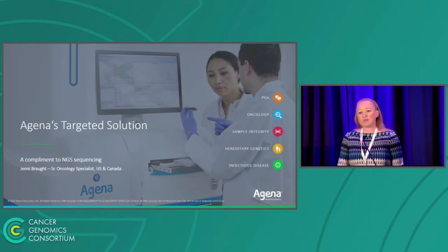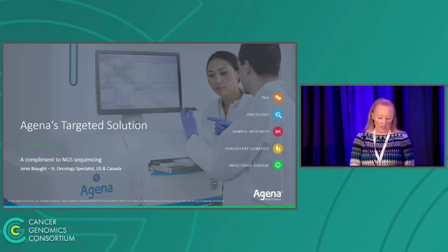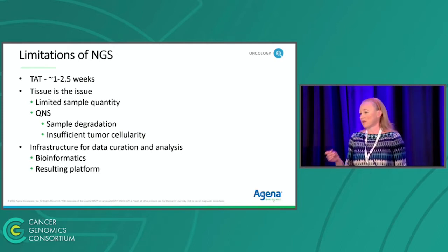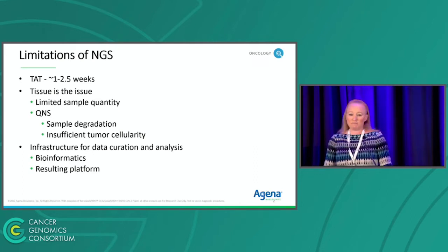All of us know that NGS is a critical part of understanding cancer genetics for both solid tumor and liquid analysis, but we also know that there are limitations. And a lot of those limitations are turnaround time. And even at the best, we're looking at a minimum of 7 days, but usually on average 2 weeks to 2.5 weeks from time of accessioning to delivering results. For a lot of patients, this is too long. Particularly an example would be those patients that are diagnosed with advanced stage non-small cell lung cancer, where we know that certain genetic identifications of alterations are critical before a patient can even be put onto a systemic or targeted therapy. As a medical director once shared with me, tissue is the issue, right?